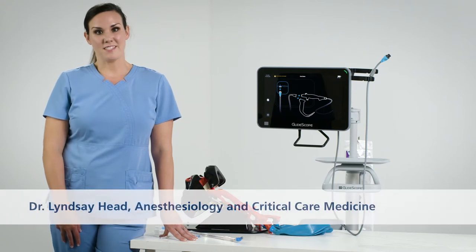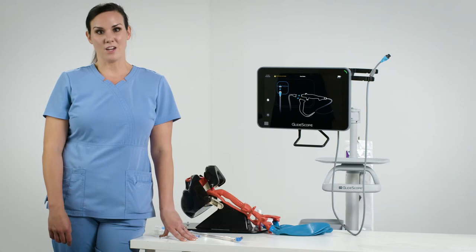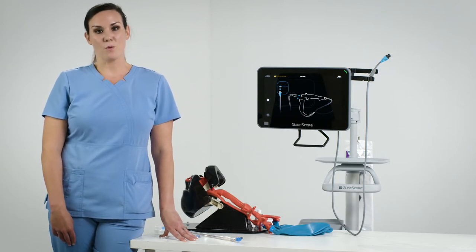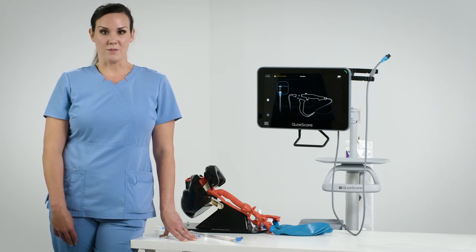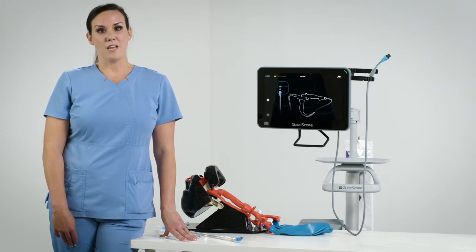Hi, I'm Dr. Head and I'm an anesthesiologist. Today I'm going to show you how to intubate using a Glidescope B-Flex 3.8 millimeter scope with a Glidescope Core 15 monitor and a 35 French double lumen endotracheal tube. The techniques in this video are my own. Please consult your owner and maintenance manual prior to using this product.